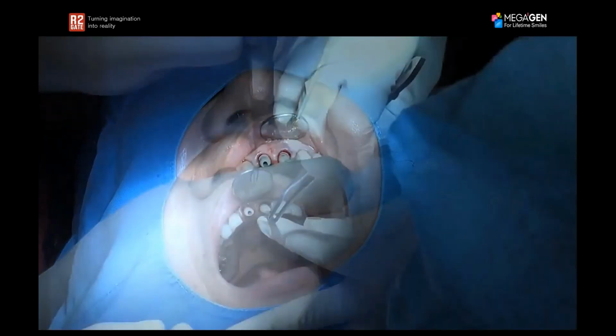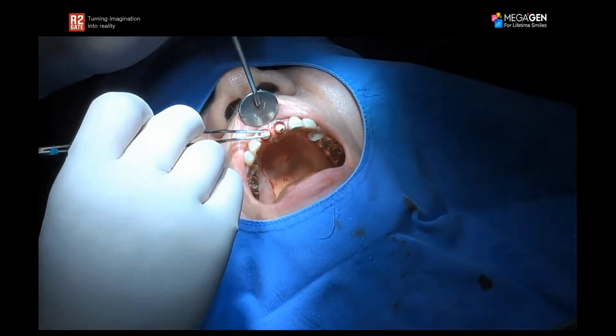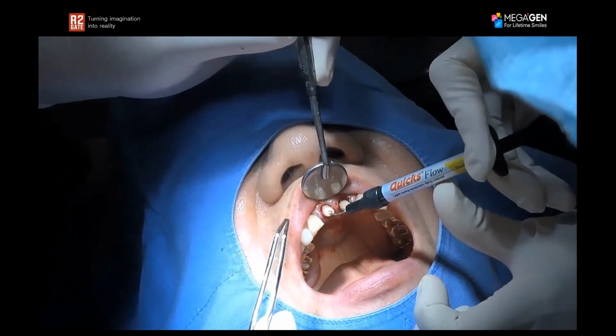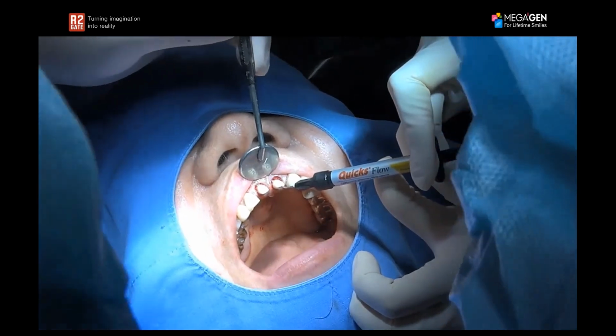So just to make sure that we could do this and it's a nice aesthetic result, we need to make sure that we do this with a cement retained type of restoration. I'll seal the openings of the screw channel using flowable composite.